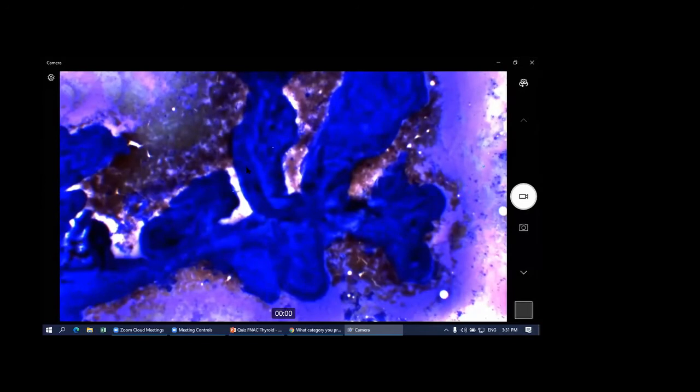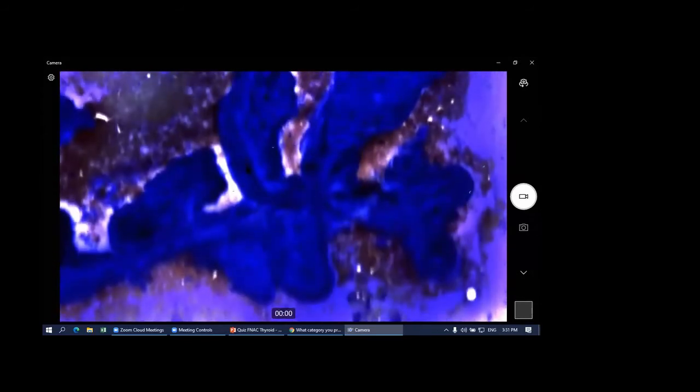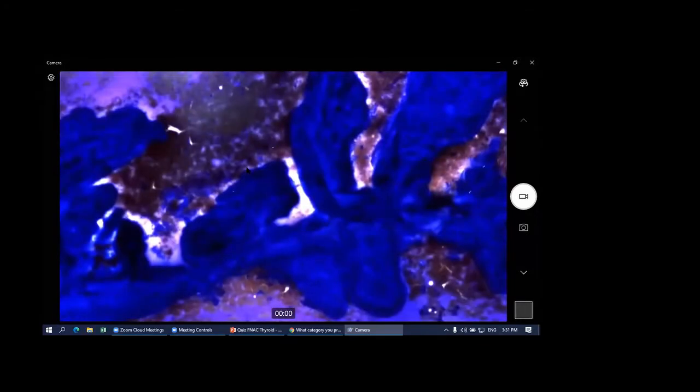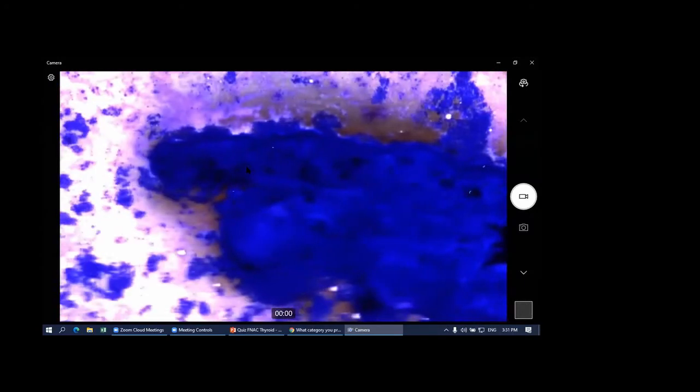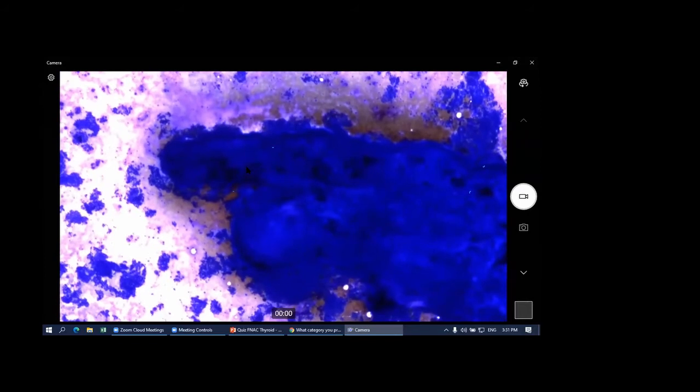Can you see that? Ooh, papillary structures. All right. I usually say a papillary structure usually has its own spaceship, and there's always a small spaceship that follows it. So that's actually the characteristic morphology pattern. Spaceship-spaceship lah.